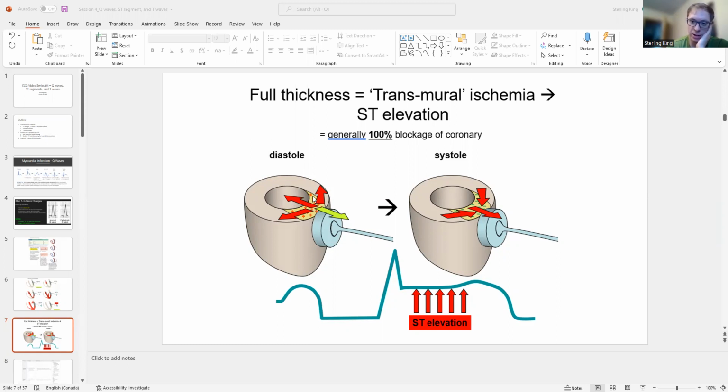Because of how the heart is now all ready to fire, it's polarized, it's got a nice negative charge. This guy who didn't polarize correctly, he kept some positives, is pushing the charge away from the electrode. So what happens is you get this baseline here, this is the baseline now, at this section of the heart.